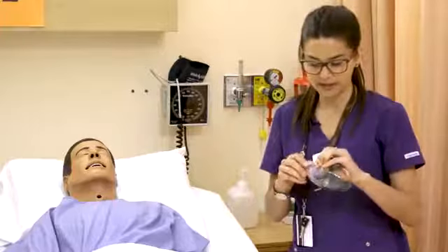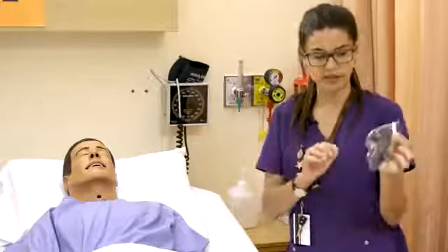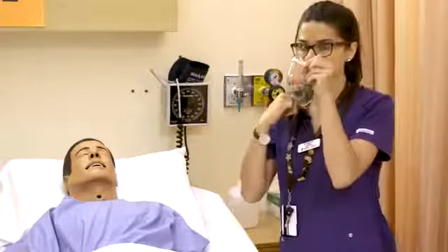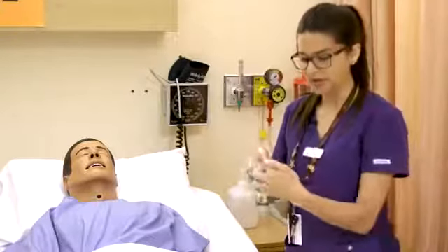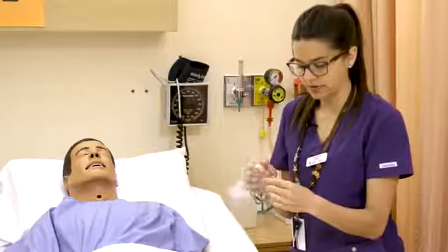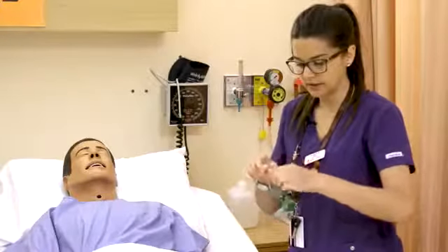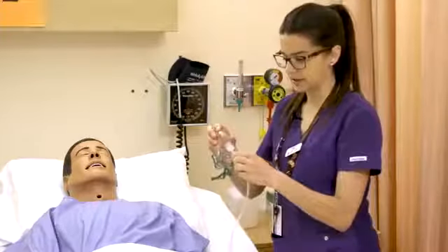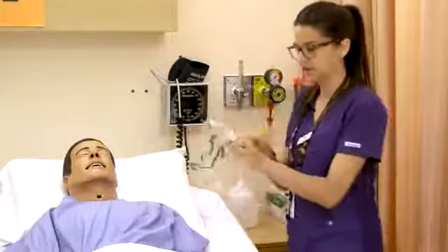So the simple face mask, it's kind of in its name, it looks just like this. It's got a nose piece and it goes over the chin, and then this goes around the person's head. Right now this is empty, so this is how you get the oxygen delivered here. You connect this connector piece into there, and then this is where it hooks up to your oxygen. So you just piece them together like a puzzle.